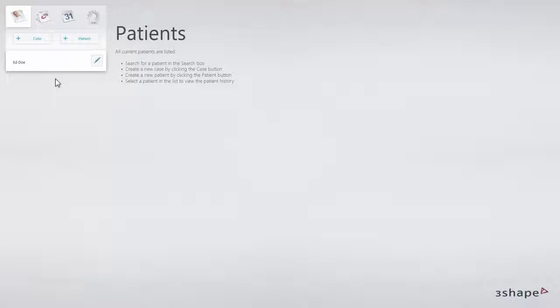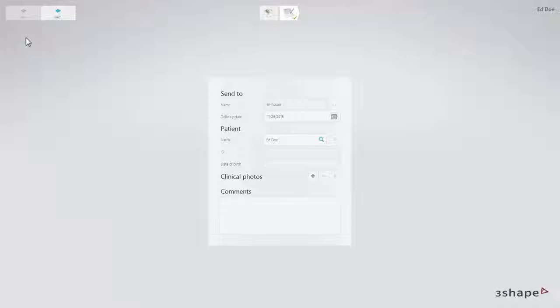The patient list will appear in the upper left corner. Click Case to create a case for the selected patient.